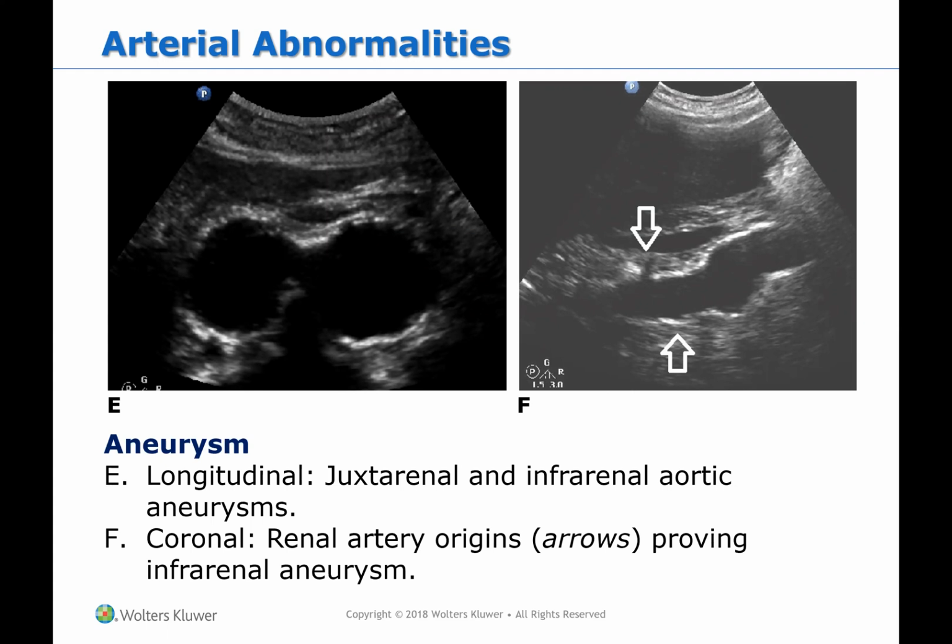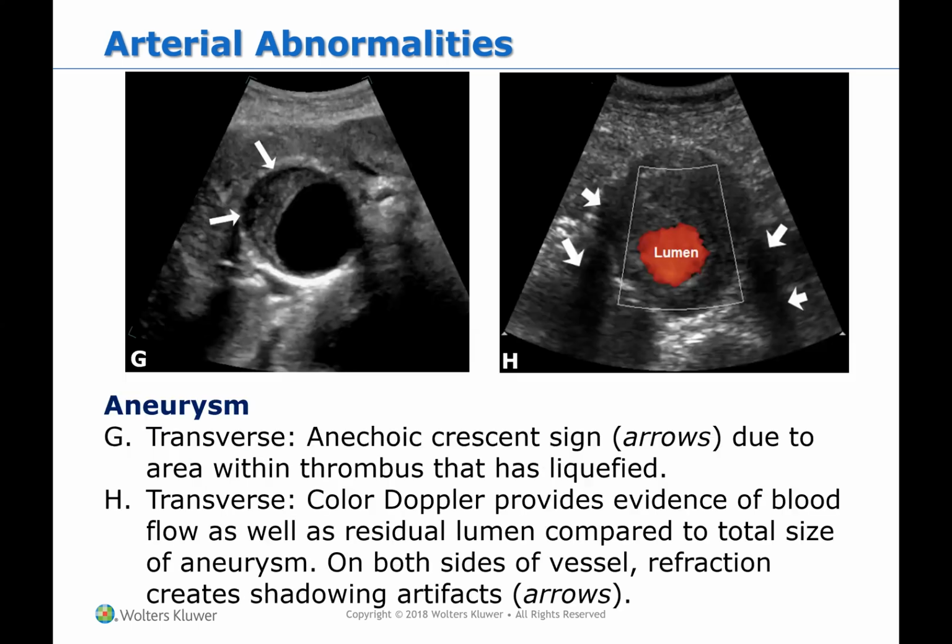You're going to see the aorta, and then the arrows there are pointing towards the renal artery. So it's like your banana peel. And then below it, you can see how the aorta is enlarged there. Look at all that thrombus and how enlarged the aorta is, but how much blood flow there is. The thrombus and blood clots appear more gray-white, while the black is more anechoic. So you can see the difference there. All part of the aorta, however.